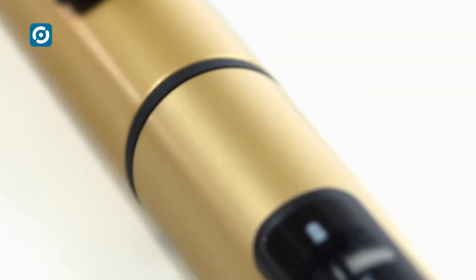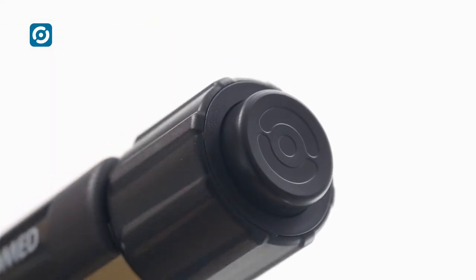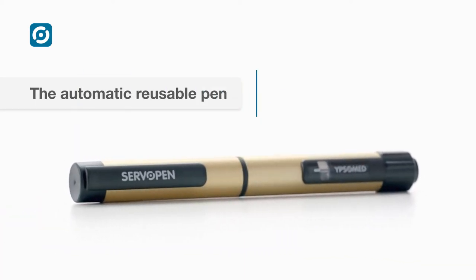High quality. Reusable. Variable dose. Automatic injection. That's ServoPen.